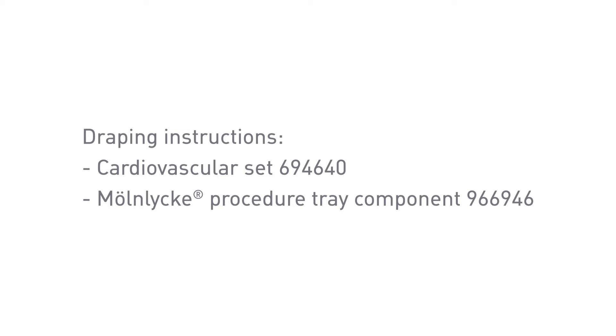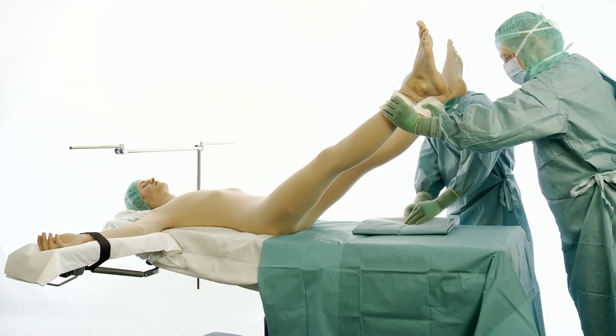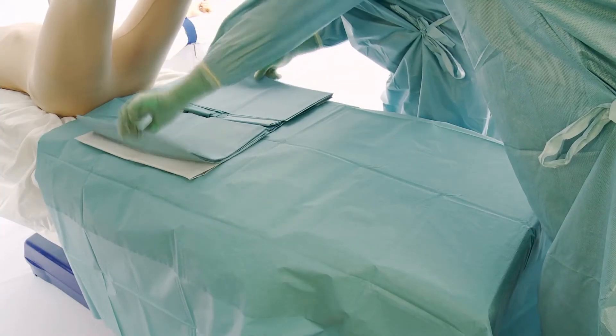Draping instruction for the Barrier Cardiovascular Set from Mernlika Healthcare. An approach drape is used to cover the operating table, then place the lower vascular drape under the patient's legs.